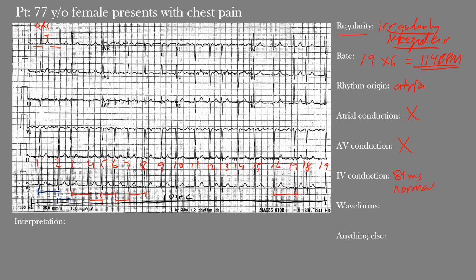How about the waveforms? P waves are not present. The T waves are present, asymmetric, and appear normal. The PR segment and interval cannot be assessed without P waves. The ST segment does not appear to be elevated or depressed anywhere. The QT interval appears within normal limits. There are no major waveform abnormalities that we can see here.